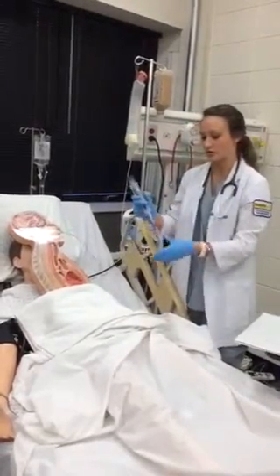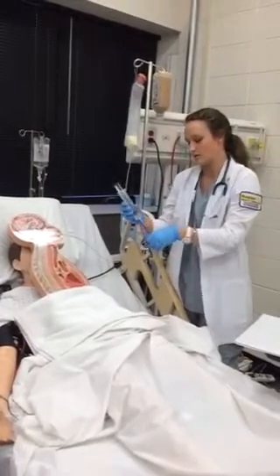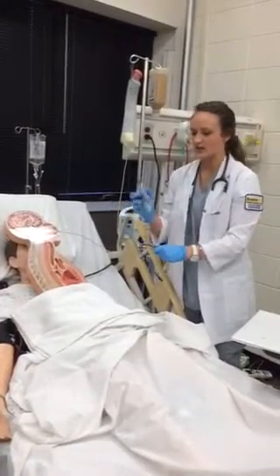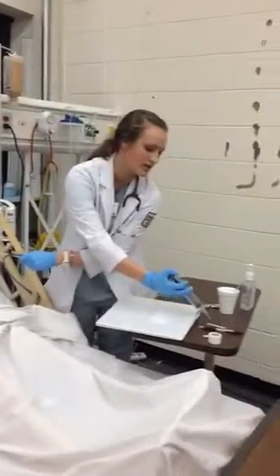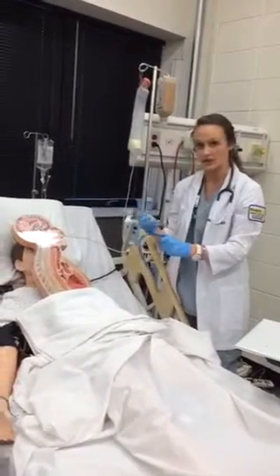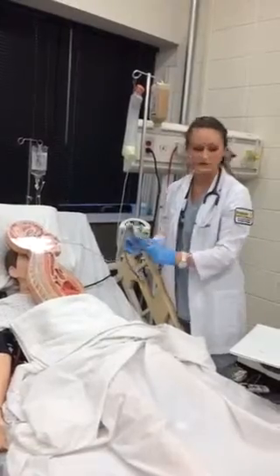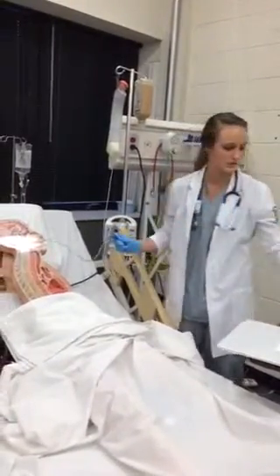And I would be observing the color of the aspirate, and also make sure my patient's not in any respiratory distress. And I have a pH strip, and we're just going to put that on the pH strip. And if it's around 4 or less, that means we know it's in the stomach because it's acidic. If it were any higher, like in the 6 range, we would know that's probably not in the stomach, maybe in the lungs. All right, so I have this clamped off when I took the syringe off.